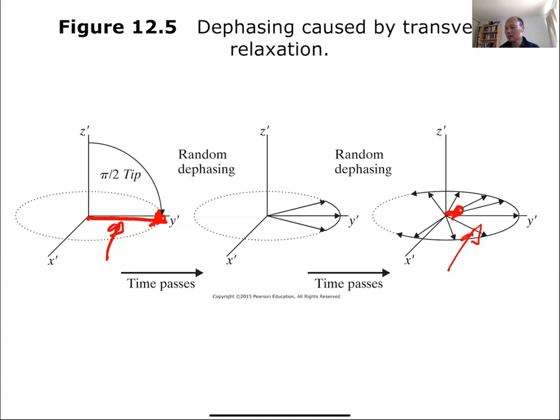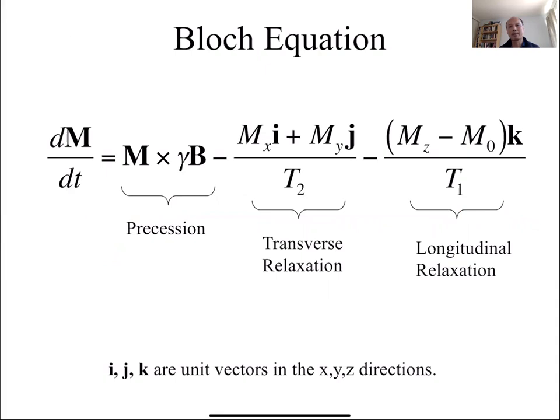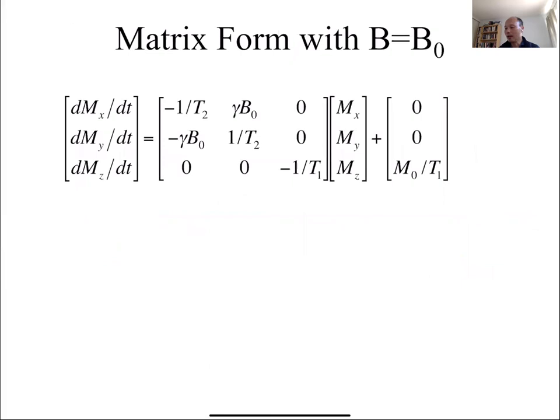So that gives rise to the Bloch equation, which is shown here. The magnetization, at least for now, has really three components. There's going to be precession around the main field. At the same time, there's going to be a relaxation in the transverse plane and relaxation in the longitudinal plane. And so we can add these terms to get the relaxation in there.